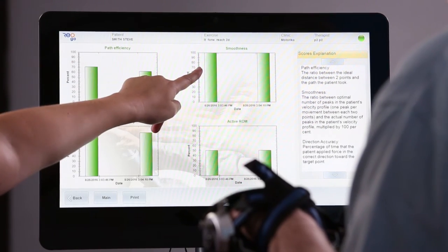Patients who have used the REOGO have experienced reduction in abnormal tone, increased range of motion, improved coordination, and less pain. The REOGO is inclusive of many different types of patients.